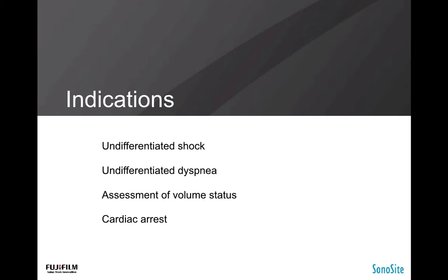The indications to perform a RUSH exam include undifferentiated shock or dyspnea, assessment of volume status, and cardiac arrest. Ultrasound is also useful for guidance of critical procedures in the shock patient, including central lines, pericardiocentesis, and thoracentesis. However, we won't cover these in today's webinar.